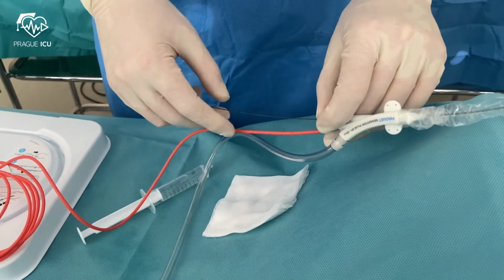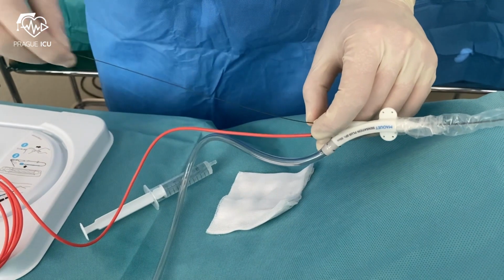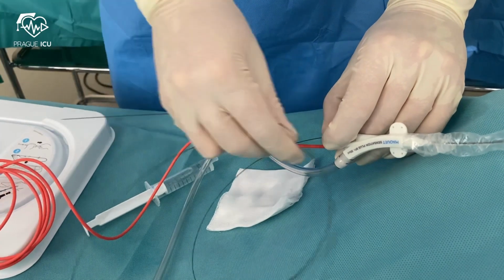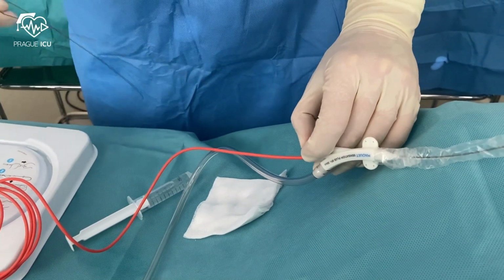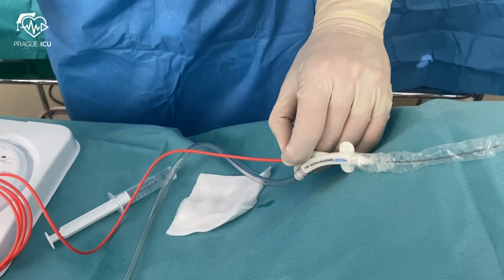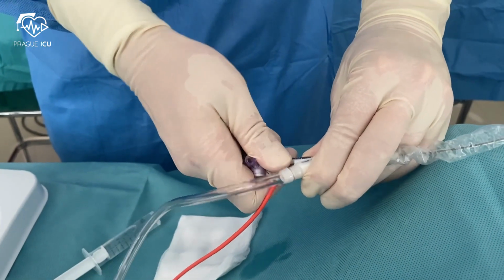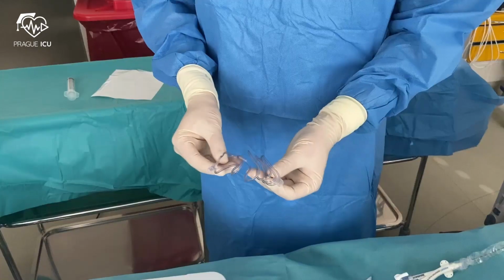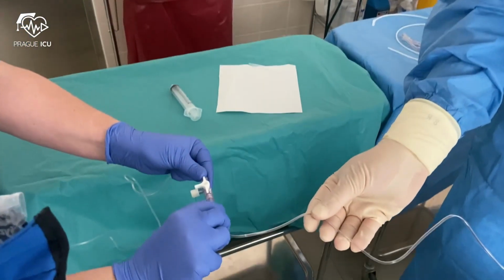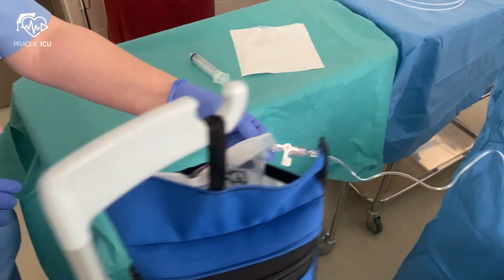Now remove the wire and attach a 3-way stopcock. Connect the tubing to the transducer and flush the lumina of the pressure tubing and balloon catheter. Then you can monitor intra-aortic pressure.